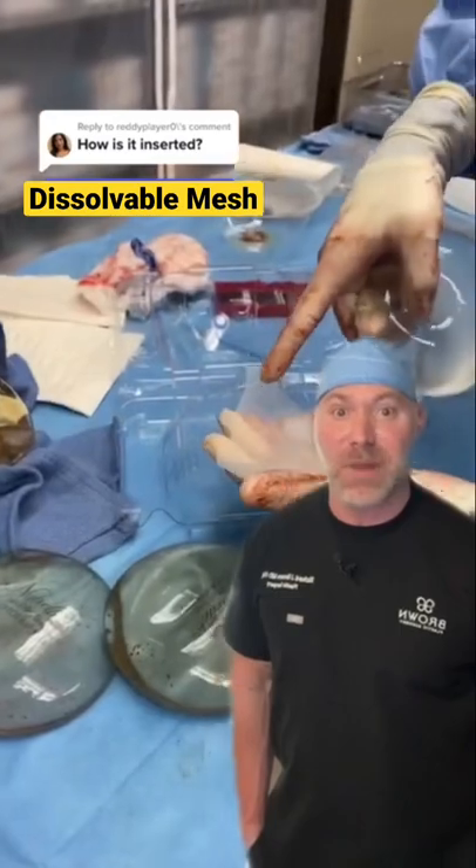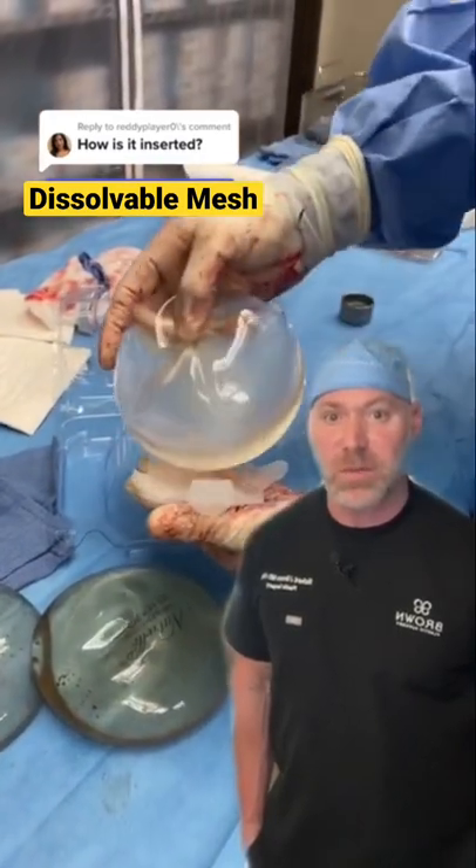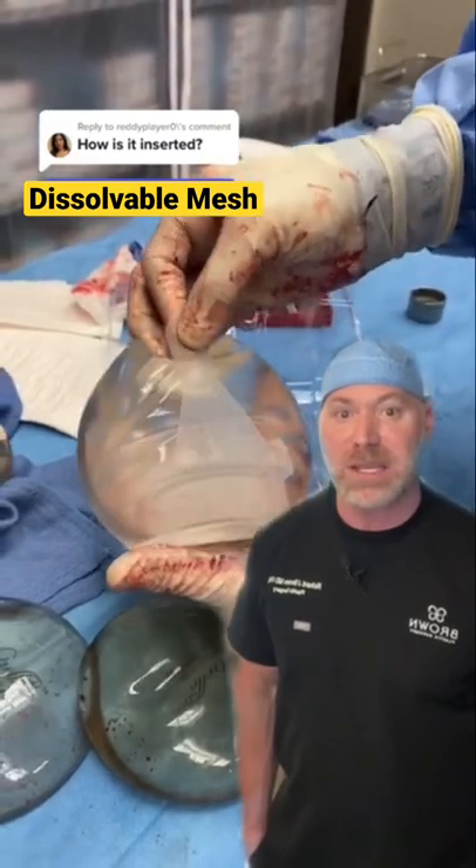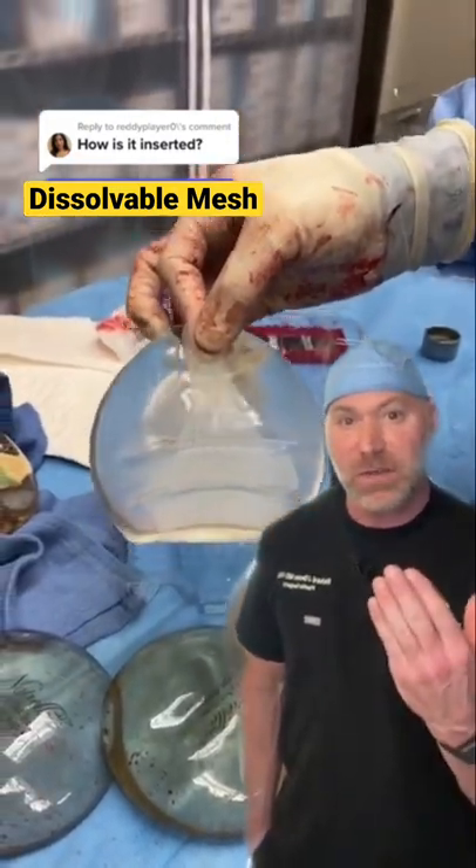How do I insert it? I place the mesh against the chest wall and suture it in place, then lay the implant on top, wrap the front part of the mesh around it to give it support and tack it to the under surface of the breast.